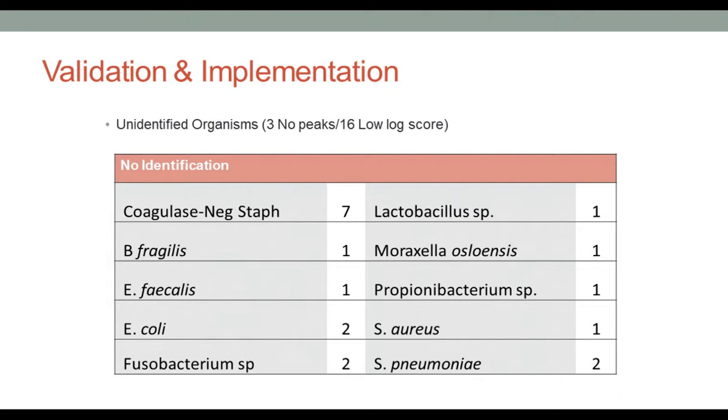There are no resistant gene markers that can be detected by this method. What are your antimicrobial stewardship committee's thoughts about that? Well, we talked about that particular issue, and we've tried to decide what would be the best option for us. The organism that they seem to be most concerned about is MRSA, and being able to detect that MRSA on these positive blood cultures.